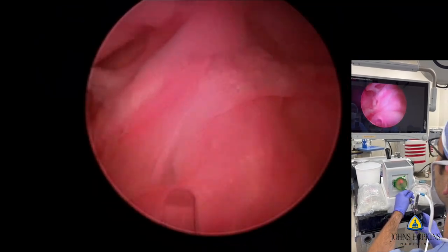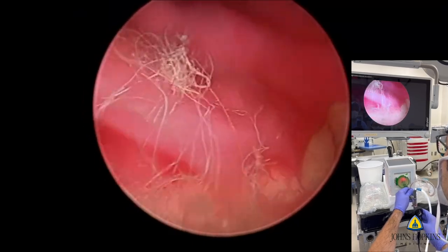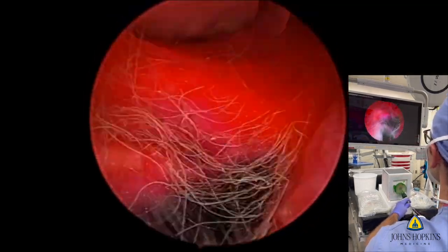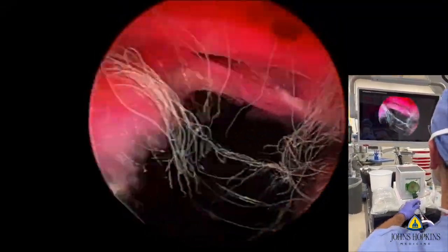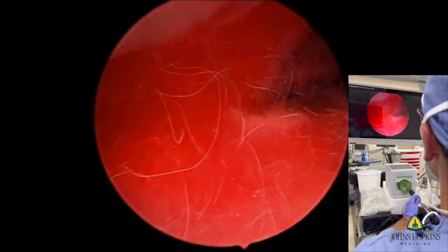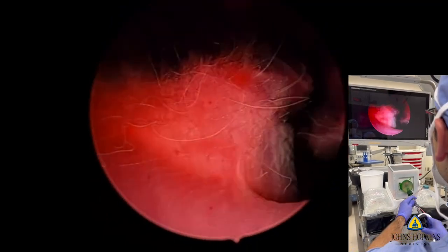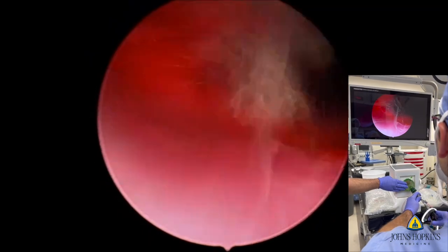The ability to do both laser dissection and blunt dissection in the model is a significant improvement. One of the most difficult things to replicate was really that bladder neck fiber dissection, and so we were able to add additives to our hydrogel to recreate those bladder neck fibers. We also changed the color, so it gives you a realistic experience of cutting through those bladder neck fibers when you're almost done with enucleating the adenoma.